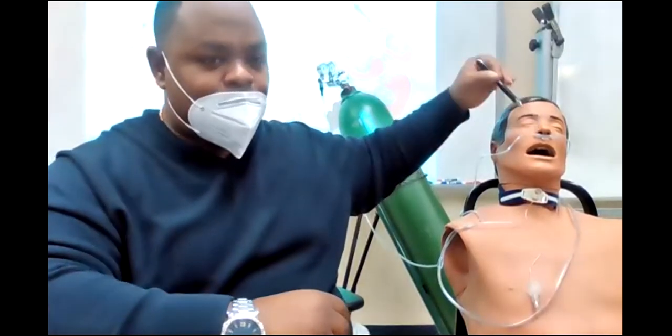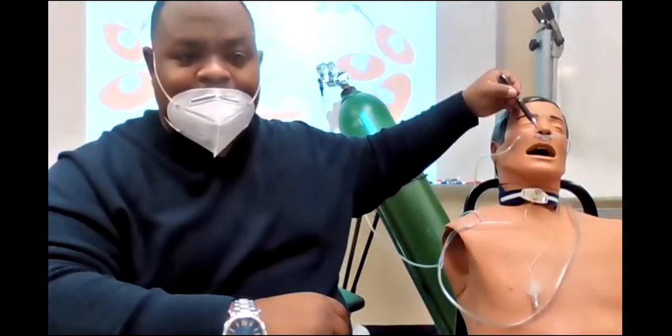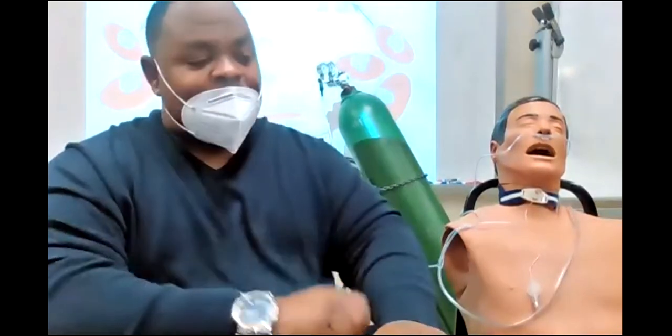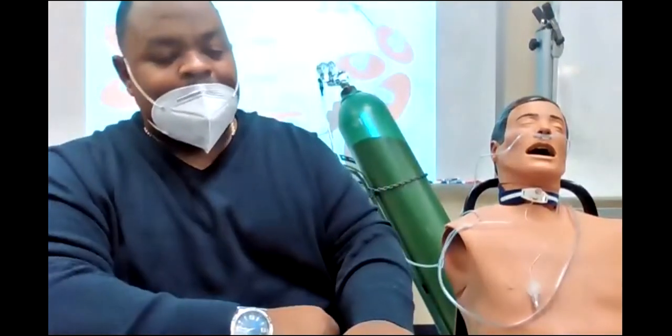If he breathes a lot of flow in through his nares, if you have extra air going through here, not only the oxygen coming from the cannula, but the air entrainment of outside air going in as well, the more volume he breathes in, the less his FiO2 will be. The less volume he breathes in, the more his FiO2 will be. But no matter how he's breathing, we cannot guarantee the FiO2 because it's a low flow device. We can only estimate what it will be. Okay, so that is the nasal cannula.